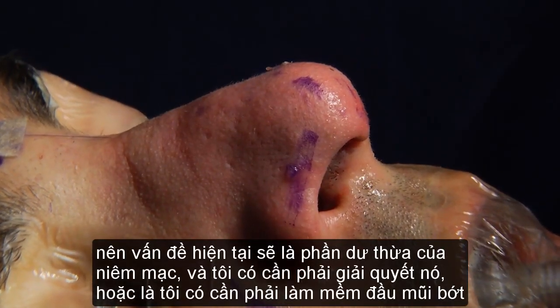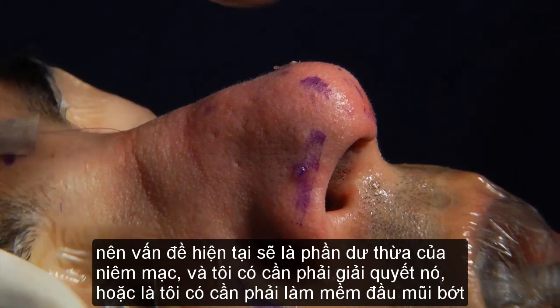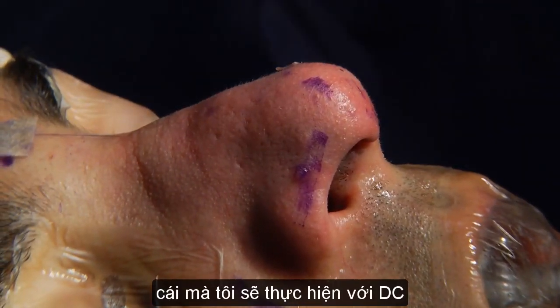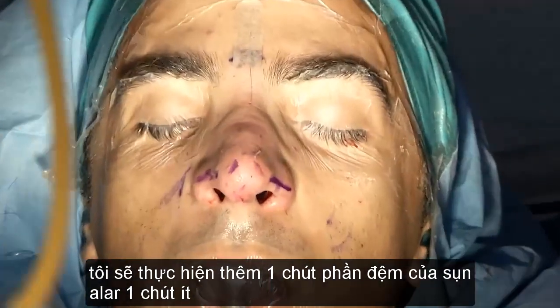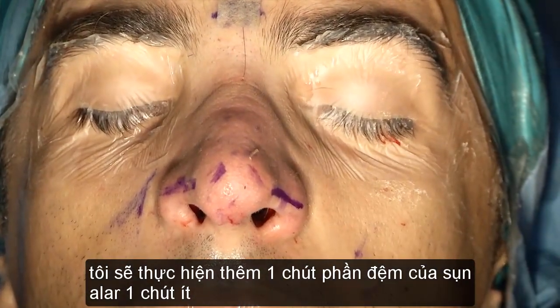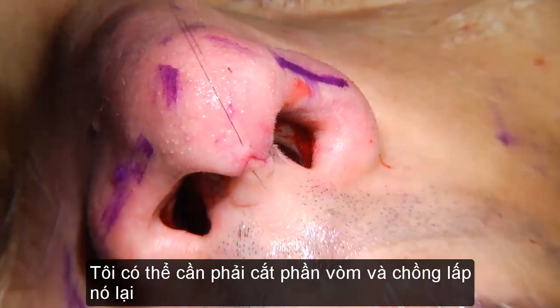So the issue is, will there be a mucosal excess? Do I have to take care of it? And do I need to soften this tip, which I will do with DC? All right. I will do a little bit of ala wedges, but it's just a tiny bit. I could have resected the domes and overlapped them.